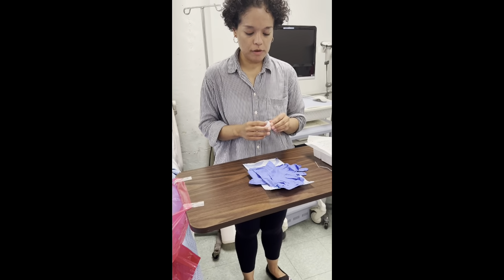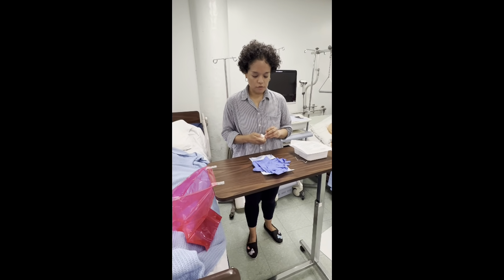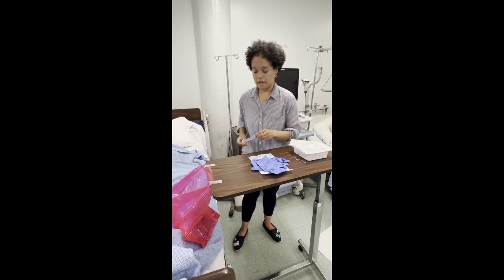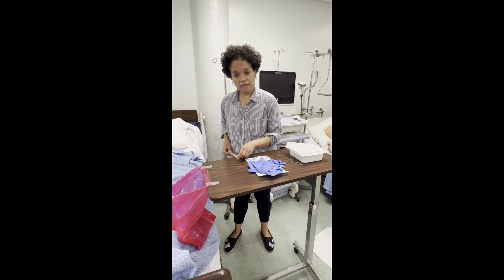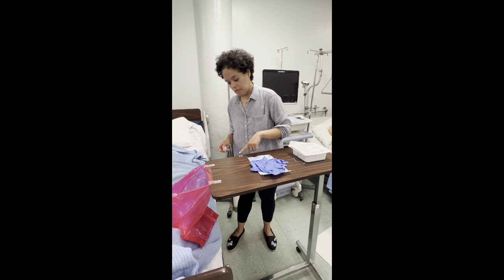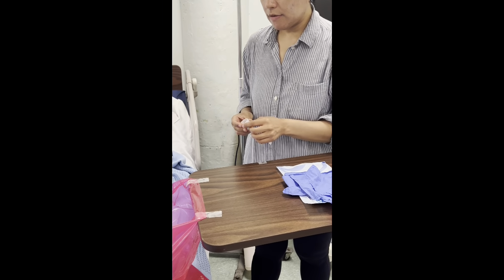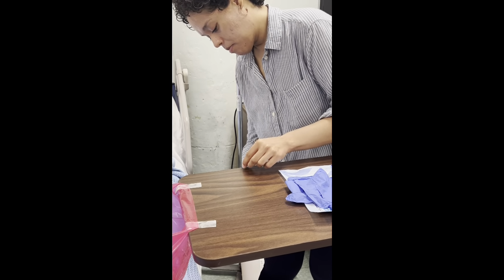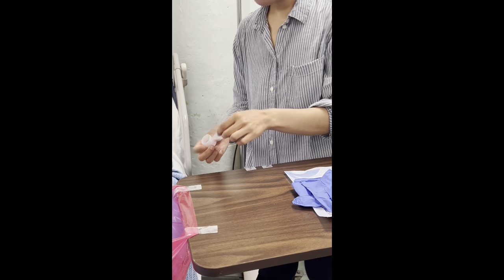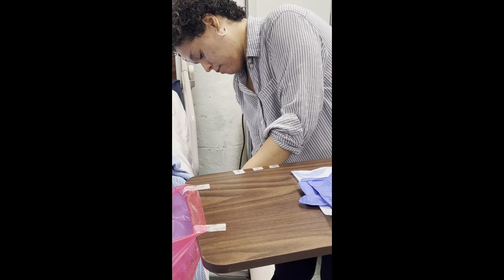And now I will be pulling out 3 pieces of tape. These pieces of tape will be used towards the end of the procedure when we are placing the dressing pad on the patient. So about 6 inches per tape. And you should have it placed at the edge of the table like so. One more. Okay.